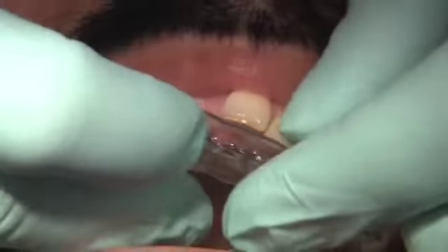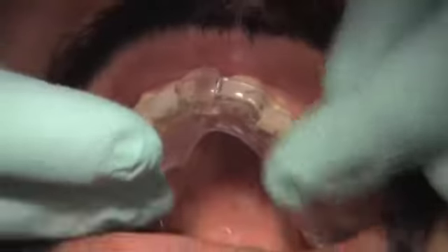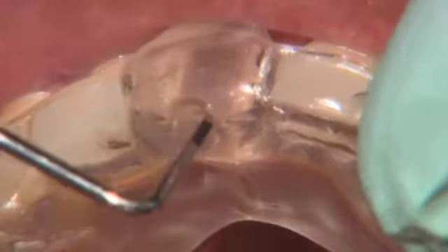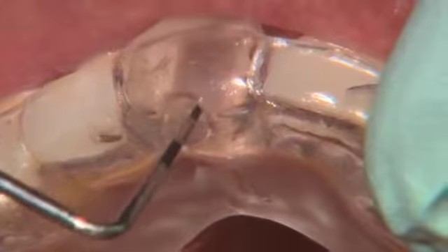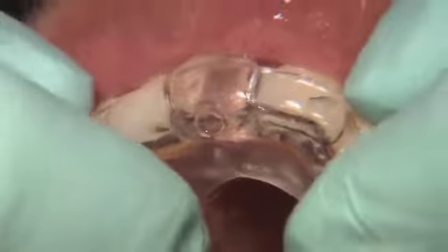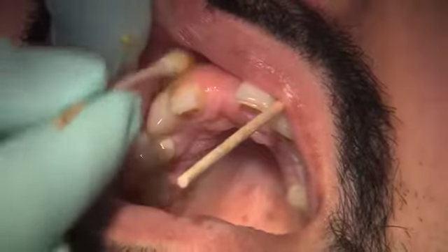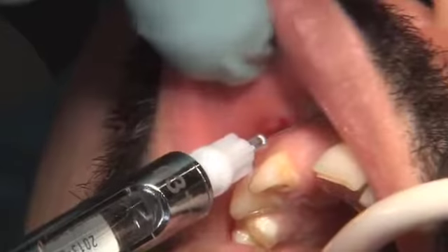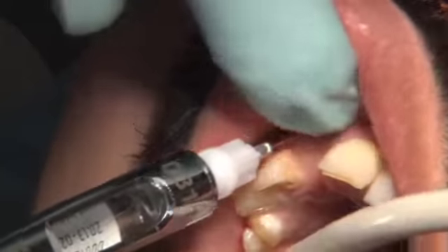First thing to do in the process is to try in the prosthetic stent to confirm the fit and the orientation of the proposed osteotomy site. And this is done with the periodontal probe, gently probing around. Once we've confirmed the fit and the alignment of the proposed osteotomy site, topical anesthetic is applied and local anesthetic delivered both to the buccal and to the palatal tissue to ensure patient comfort.